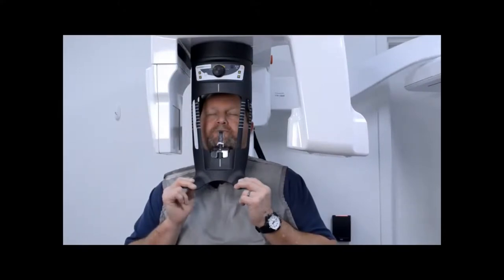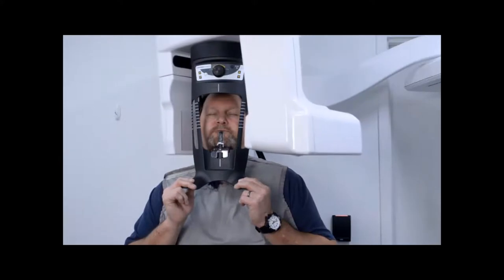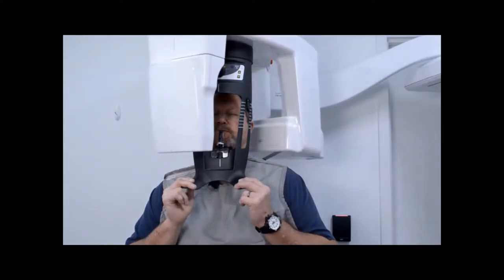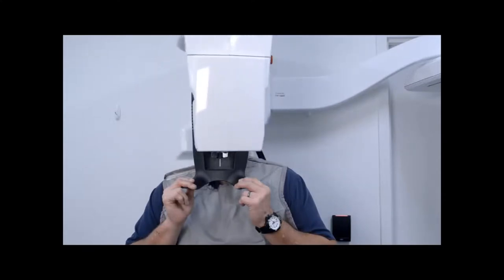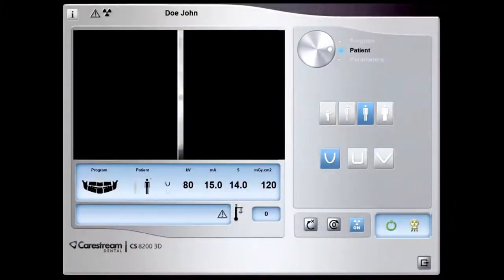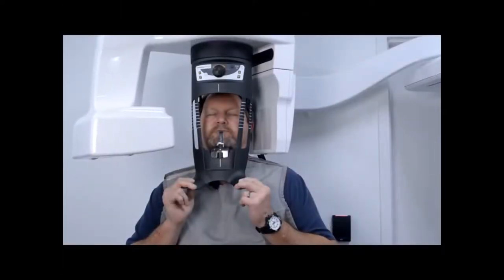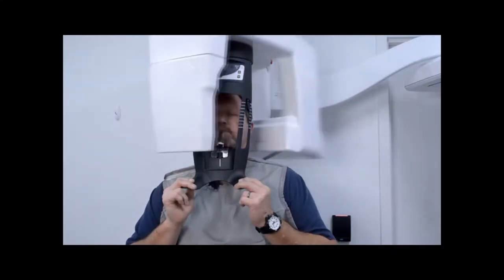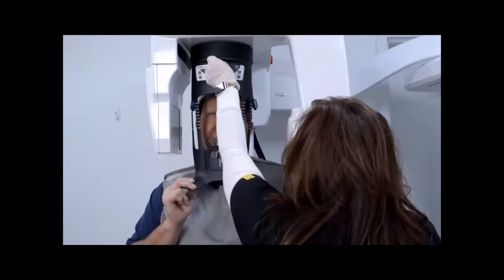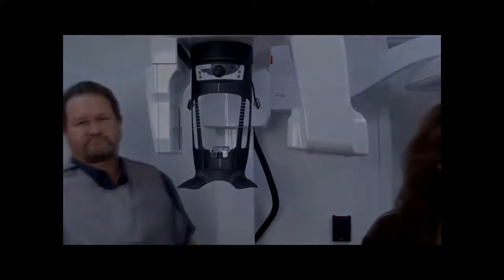Exit the room. Maintain visual contact with the patient throughout the duration of the exposure. Launch the x-ray with the remote control. Simply press and hold the exposure button until the end of the acquisition is indicated by the on-screen release hand switch message and a short beep. The x-ray exposure indicator turns yellow and a warning sound is heard during x-ray emission. When the acquisition ends, the acquired image is automatically transferred to the imaging window. After the acquisition is complete, return to the room, release the patient, and remove the hygiene barrier from the bite block.